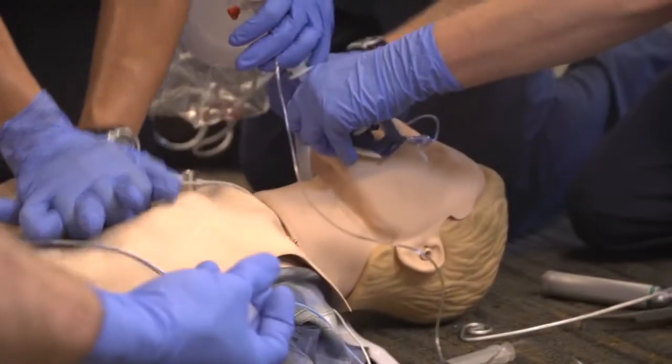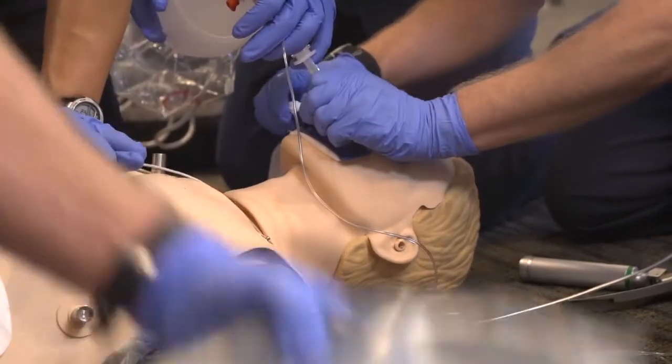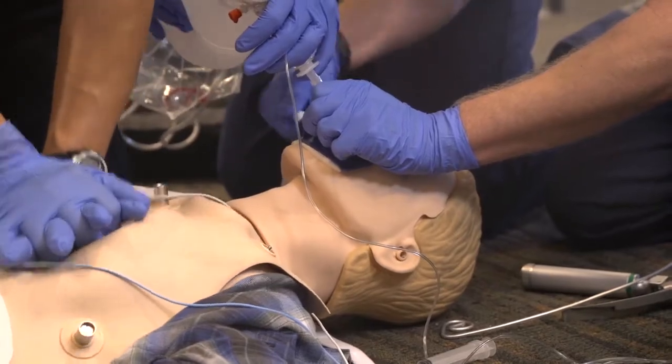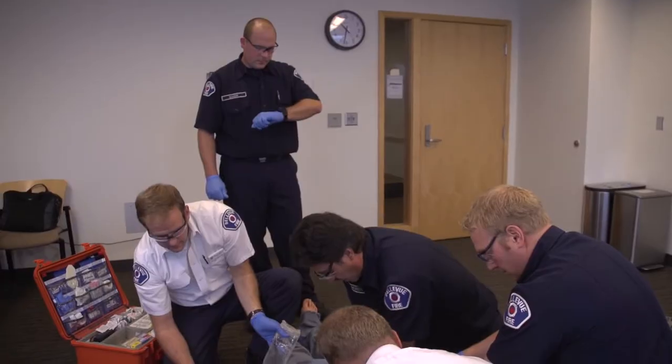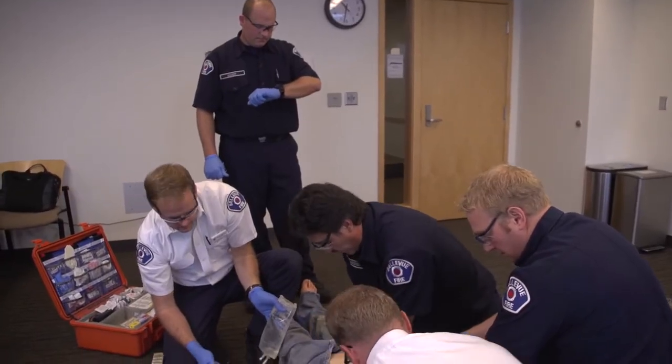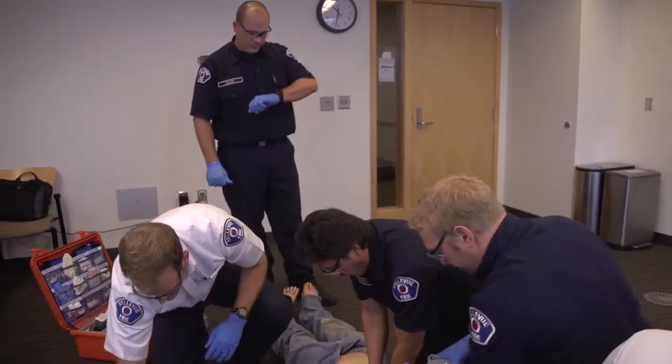Just get this secured, Kevin, and then I'll do it — be able to help now. 9, 10. 9, 10. 1 milligram of epi on board. 8, 9, 10. Bagging okay, Andrew? Bagging good. 9, 10. Get your position back.